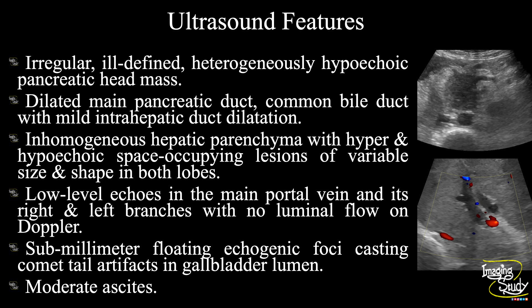In summary: an irregular, ill-defined, heterogeneously hypoechoic mass lesion is noted at the head of the pancreas, causing dilatation of the main pancreatic duct and common bile duct, with mild intrahepatic biliary tree dilatation. The hepatic parenchyma appears inhomogeneous with multiple hyper- and hypoechoic space-occupying lesions of variable size and shape involving both lobes. There are low-level echoes in the main portal vein and both right and left branches with no detectable luminal flow on Doppler. Sub-millimeter floating echogenic foci casting comet-tail artifacts are noted within the gallbladder lumen, with moderate ascites. These features conclude a case of malignant pancreatic head mass causing biliary tree and main pancreatic duct obstruction, with hepatic metastasis, portal venous thrombosis, biliary sludge, and moderate ascites.